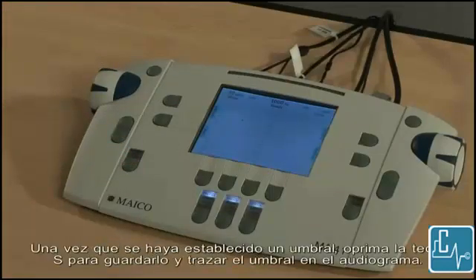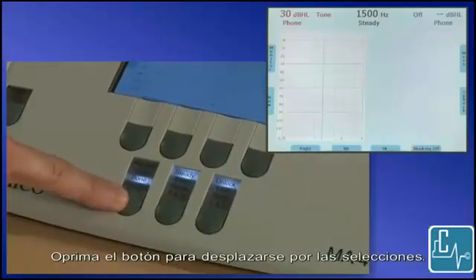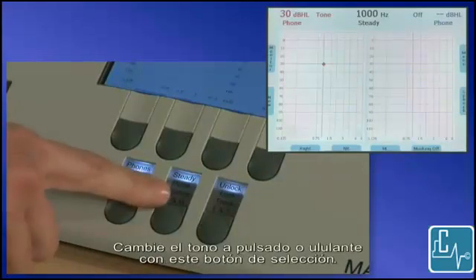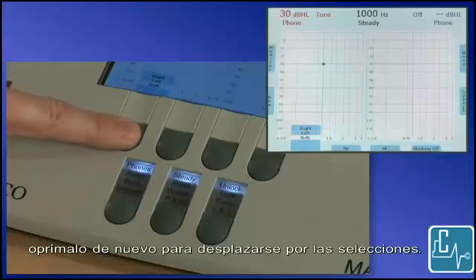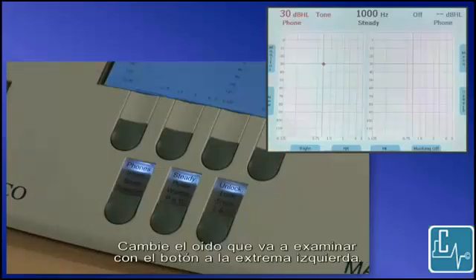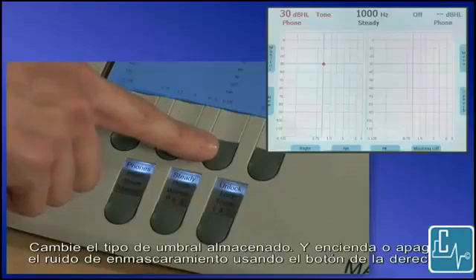Once a threshold is established, press the S key to save it and plot the threshold on the audiogram. Let's look at the bottom row of buttons. Transducers can be selected with this button. Press the button to toggle through the selections. If a selection does not light up, it is not calibrated and therefore not activated. Change the tone to pulse or warble with this selection button. Next to that, you can select to lock the stimuli of the two channels or track the channel levels together. Buttons around the color screen change function depending on the screen you are in. Press the button once to show the list of items and press again to toggle through the selections. Labels on the bottom of the screen display the current status of the test selections. Change the test ear with the button on the far left. Mark a threshold as no response using the NR button. Change the type of threshold stored and turn masking noise on or off using the button on the right.